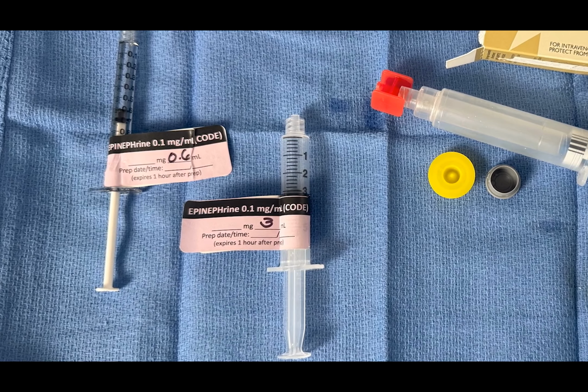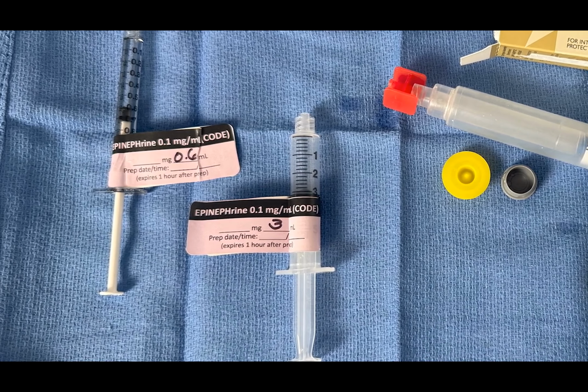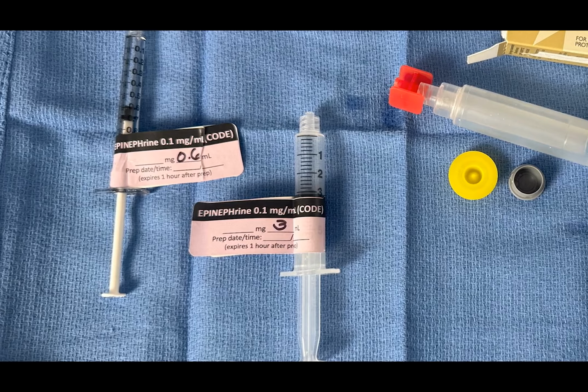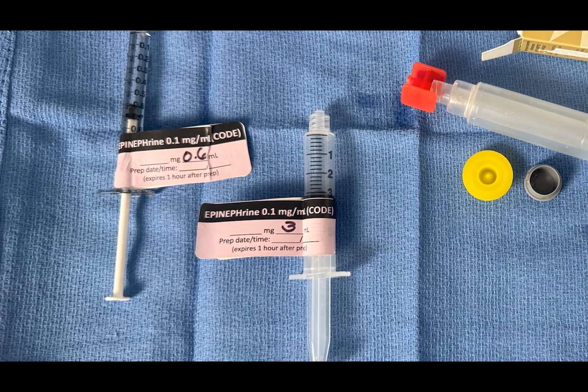Check your hospital policy for labeling code medications. If you set the syringe down or hand it to someone else, you should label it. Position the label so you can see how much epinephrine is in the syringe.